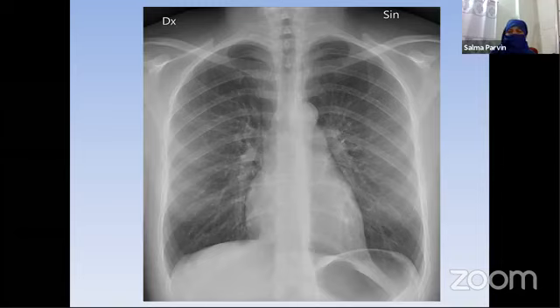I think it is very difficult for a patient to stand in this way, and to get such a properly positioned film is not very simple. This is a very much calculated study that needs so much technical application from the patient's side and also the technologist's side.